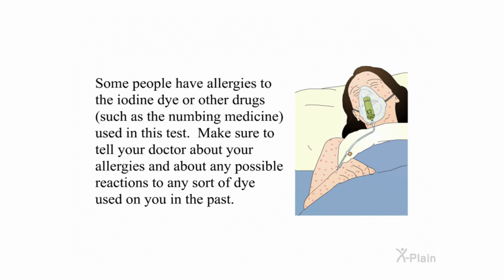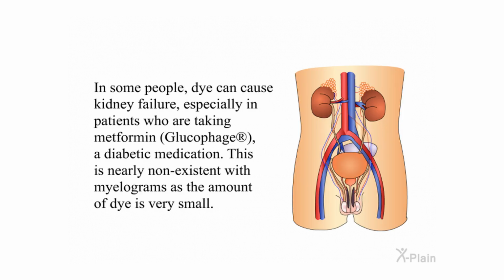Some people have allergies to the iodine dye or other drugs, such as the numbing medicine, used in this test. Make sure to tell your doctor about your allergies and about any possible reactions to any sort of dye used on you in the past. In some people, dye can cause kidney failure, especially in patients who are taking metformin, also known as glucophage, a diabetic medication. This is nearly non-existent with myelograms as the amount of dye is very small.